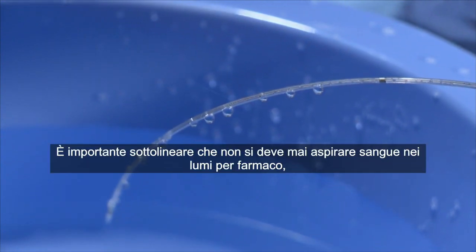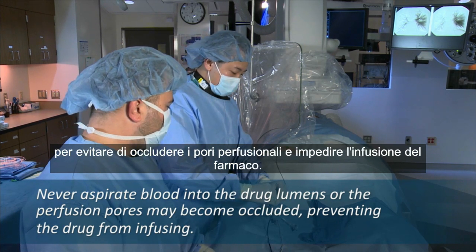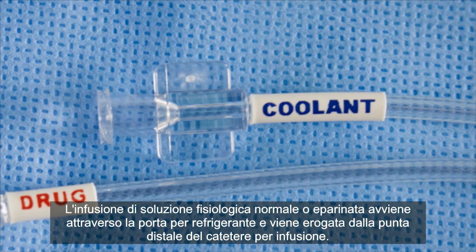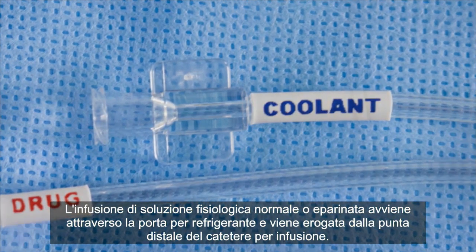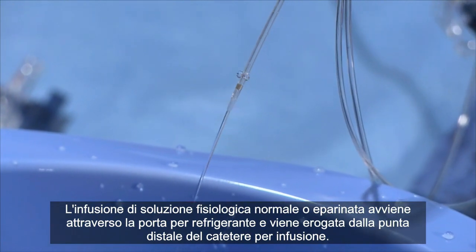It is important to know that you should never aspirate blood into the drug lumens, or the perfusion pores may become occluded, preventing the drug from infusing. Normal or heparinized saline will infuse through the port labeled coolant and exit the distal tip of the infusion catheter.